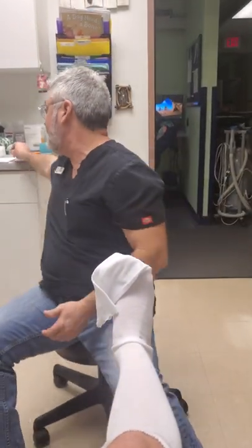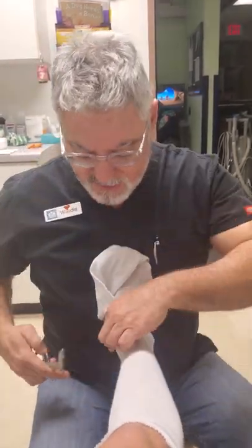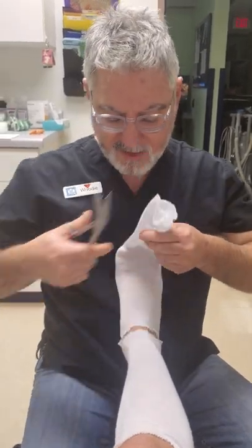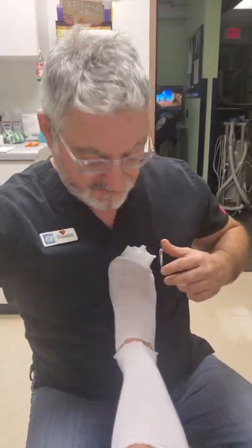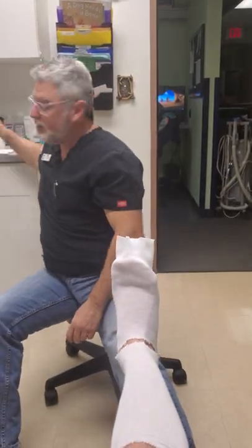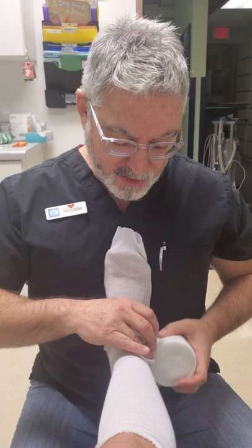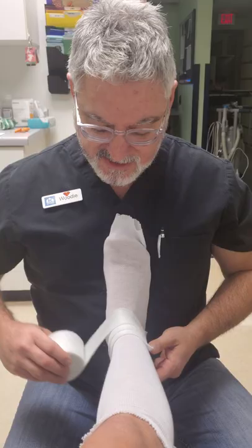Somebody asked me to do a cast stand video, which I did. You can do that either way, but because we're doing a demo here and I want to make sure you guys see everything we're doing, I'm going to do this up in the air. We know this isn't the normal way you would make the cast, but I want to make sure to show you guys. So we're going to start with the stockinette, then move on to the cotton padding.